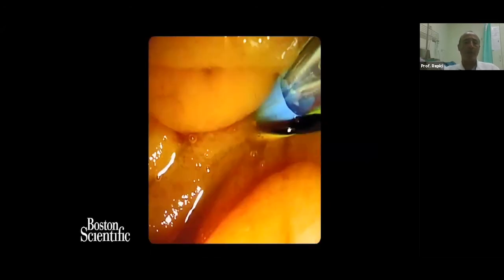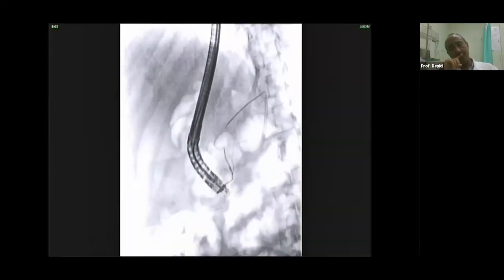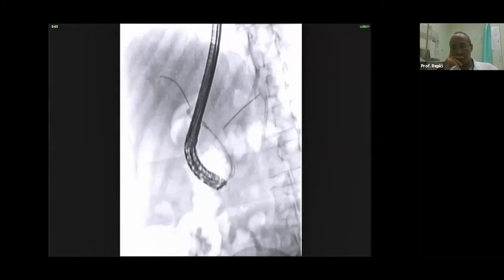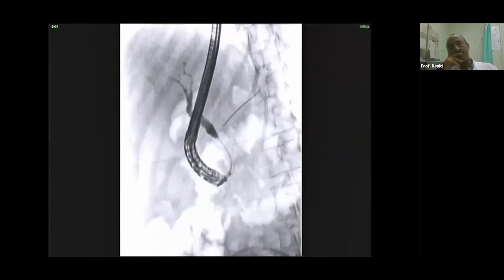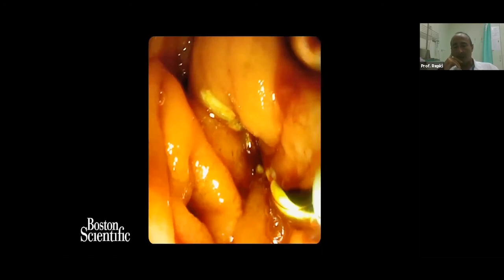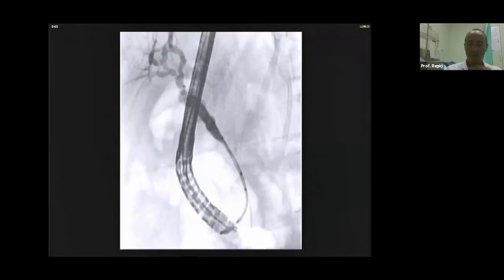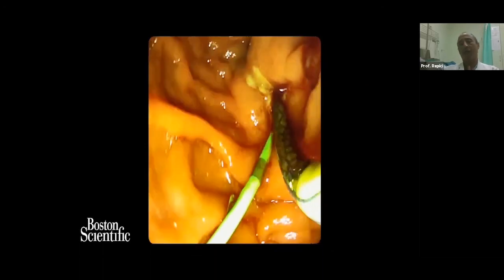You see, mostly we were able to replicate the same kind of small movements that we normally do to get the bile duct deeply. You can see the results: successful biliary cannulation, cholangiogram showing the tight strictures at the level of the pancreas, and placement of a metal stent. We first placed a pancreatic stent because we had the pancreatic wire, and afterwards we placed a metal stent for palliation of this tight stricture at the distal common bile duct. Overall, the functionality looks quite nice.